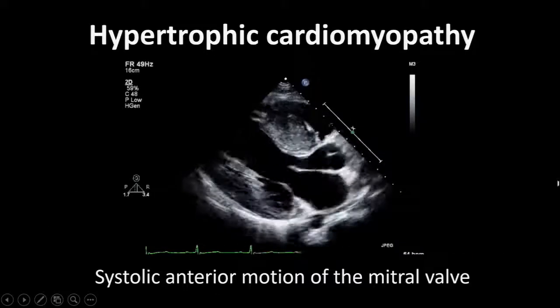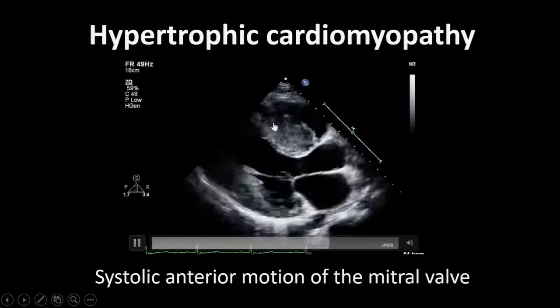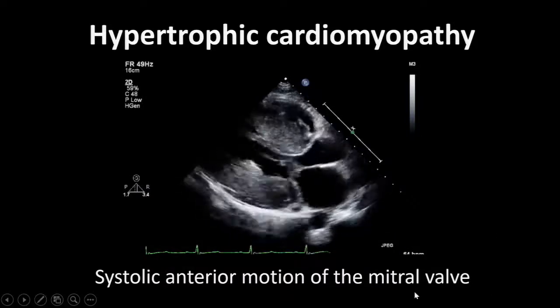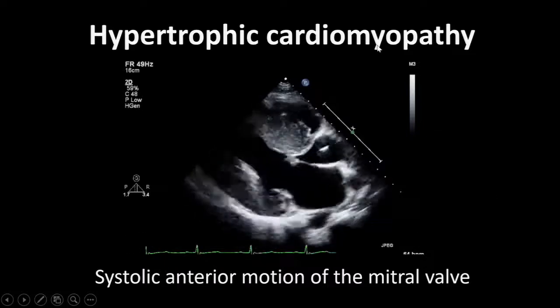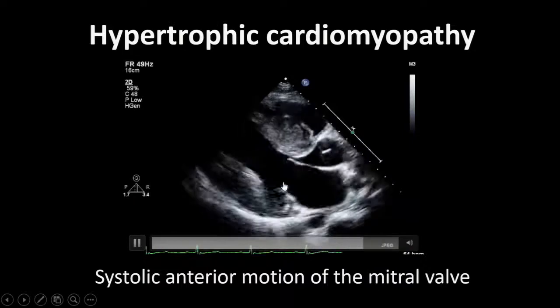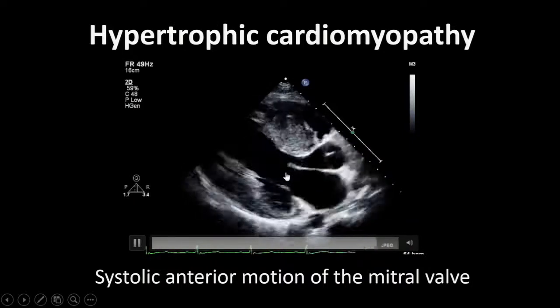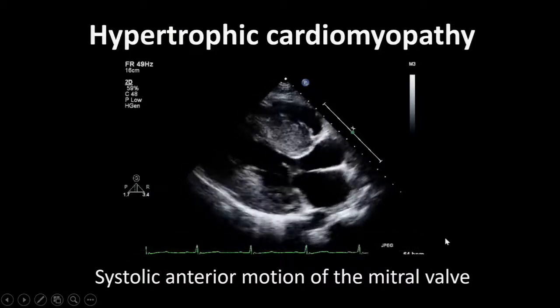Example of hypertrophic cardiomyopathy. Here you can see the severe thickening of the basal and mid-septum here. In addition, this patient has systolic anterior motion of the mitral valve, which is commonly associated with hypertrophic cardiomyopathy that has left ventricular outflow tract obstruction. You can see normally in systole, the mitral valve should fold up back here and stay out of the way of the left ventricular outflow tract.